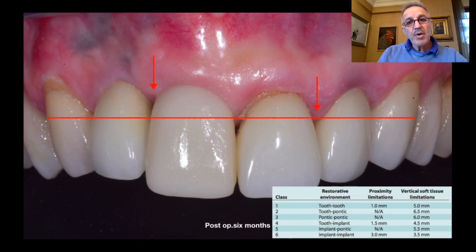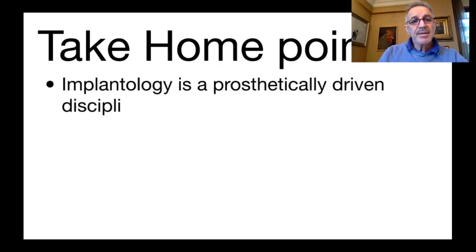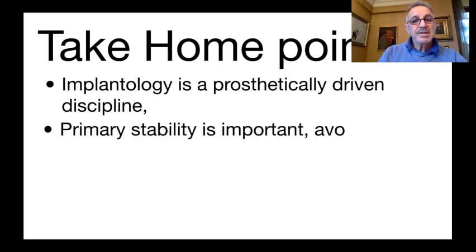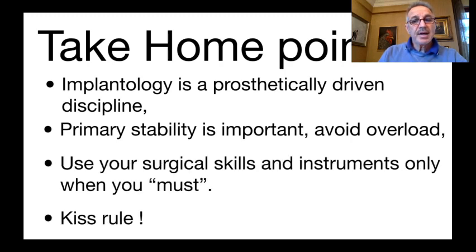Yeah, this is the case. I hope you learned something from the case. For take-home points, don't forget that implantology is a prosthetically driven discipline, so you should always obey your prosthesis rules. And primary stability is important, and avoid overload. And use your surgical skills and instruments only when you must. And of course, the KISS rule.